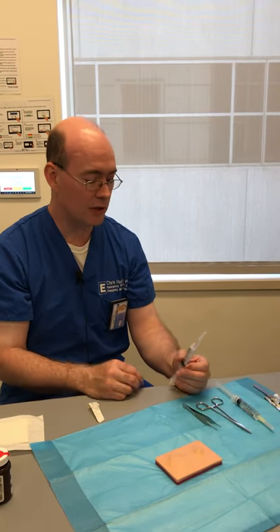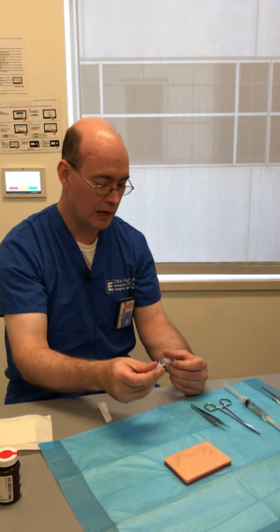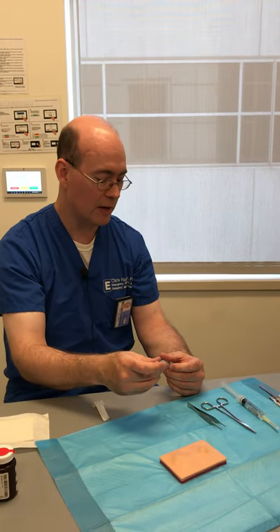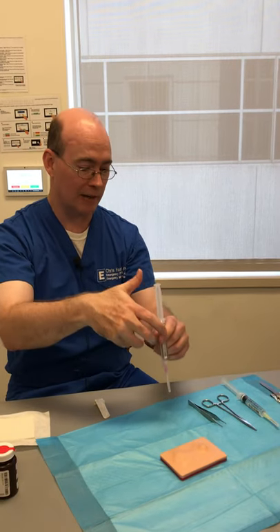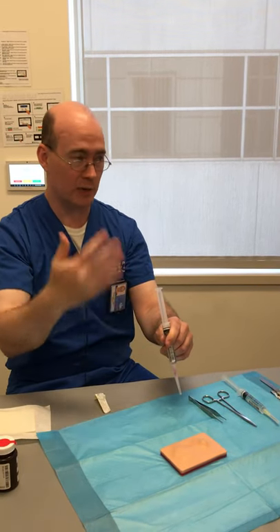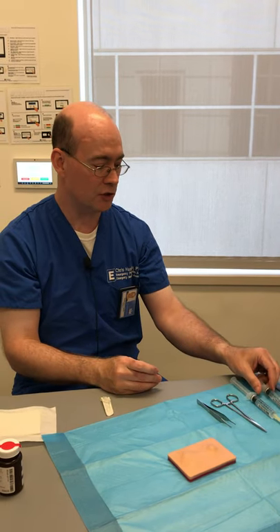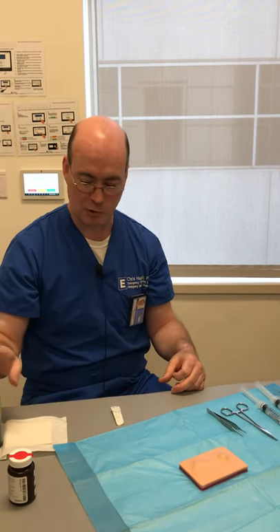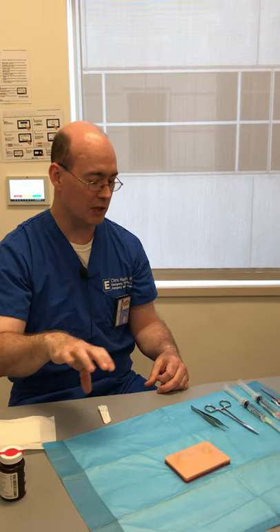You're going to want something to flush it with. This IV catheter can work, but ideally you'd want something bigger. They also have things called zero-tip syringes — they screw on the end of a syringe, it's a little plastic dome, and it lets you produce a jet of fluid without spraying all over yourself. Usually the suture tray will have some basins — pour some betadine in one basin and some sterile saline in another for flushing and cleaning.